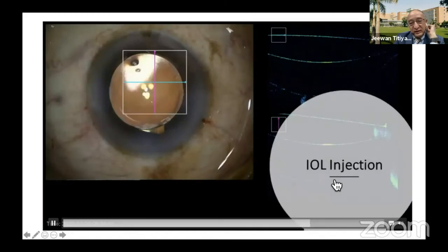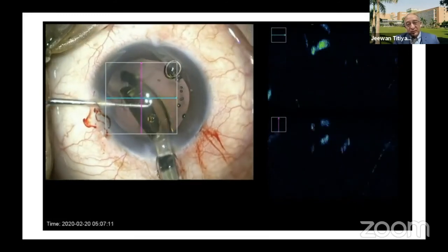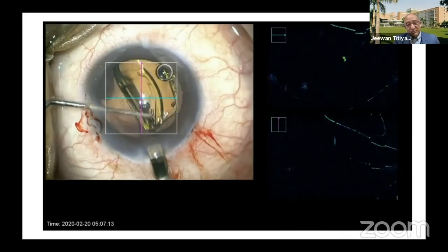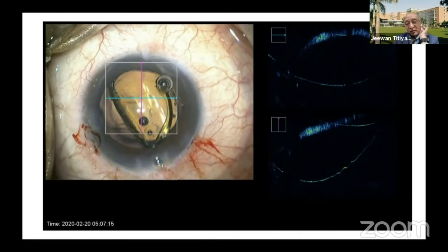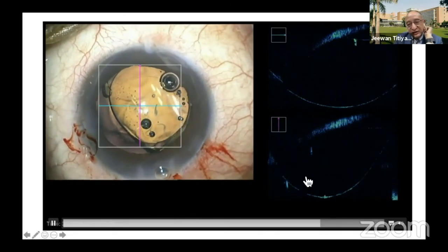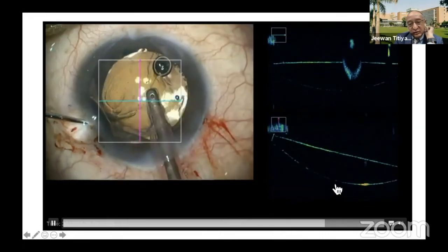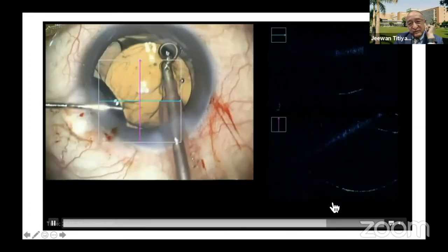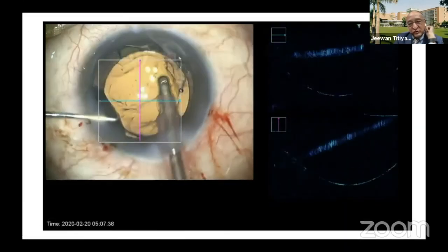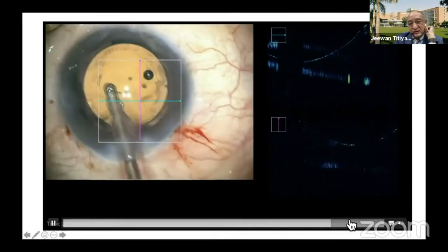This is helpful in deep chambers, especially in high myopic patients or where you have a loose bag also. Implantation of the IOL can be safely done, but sometimes the extent, the depth of the IOL, and the tilt can also be appreciated by IOCT here. So this is a distortion of a wound which happens with the IOL injection. The various IOL injection techniques can be compared by looking at the distortion of the wound in these cases.